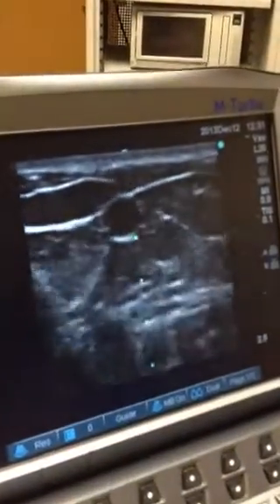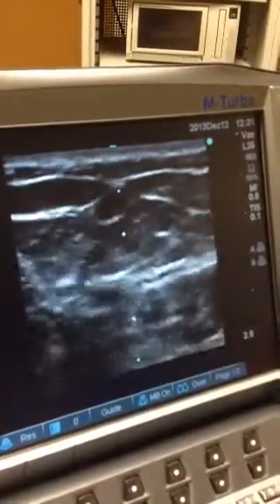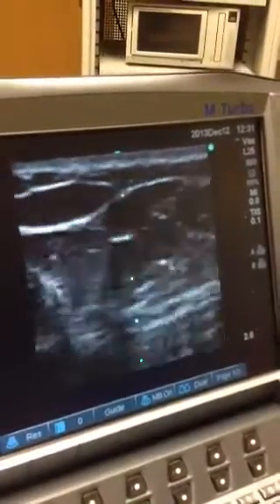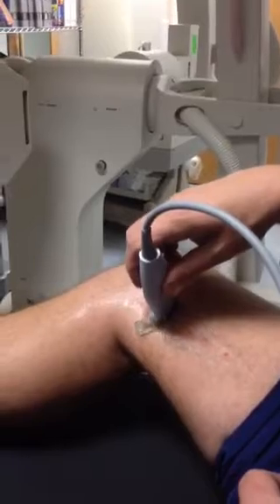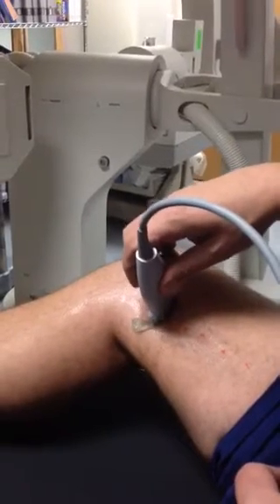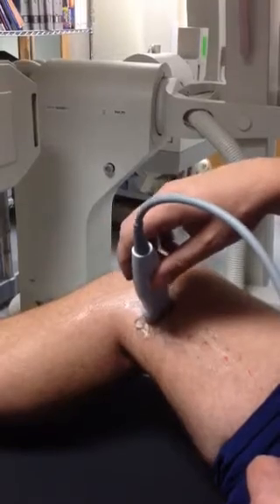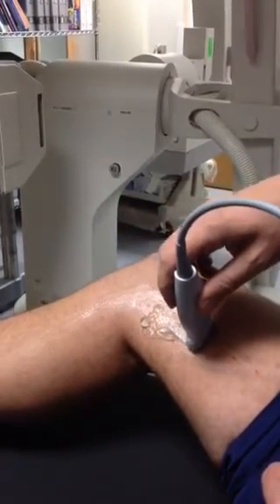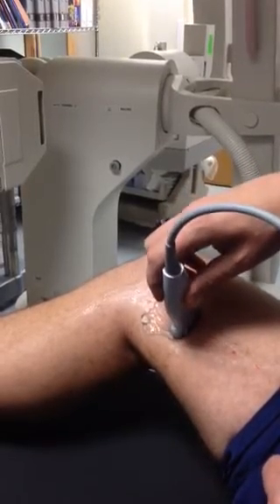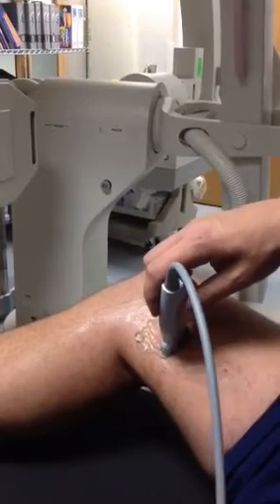It's fairly superficial, and you can confirm it by pushing up and down on the leg. You can see the greater saphenous actually winking at you like an eyeball. If you just slowly push up and down, you can confirm that you have the greater saphenous vein or not. While probing, you don't want to push down — you want to run the probe on the surface of the leg so it slides. If you push down while trying to find it, you're actually going to collapse the vein and won't be able to locate it.